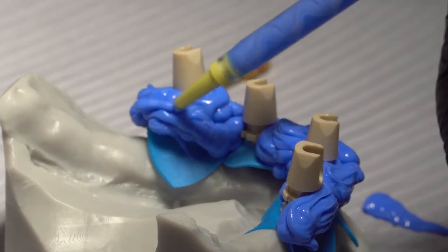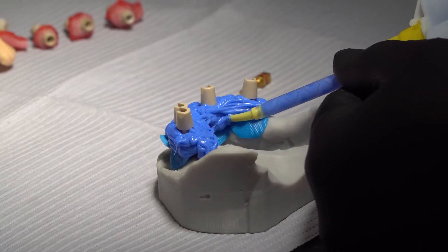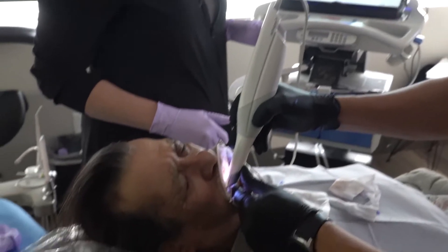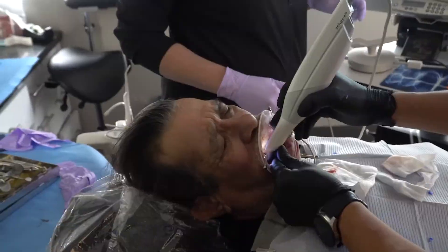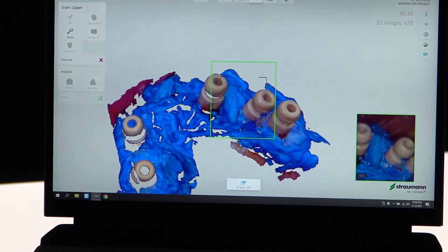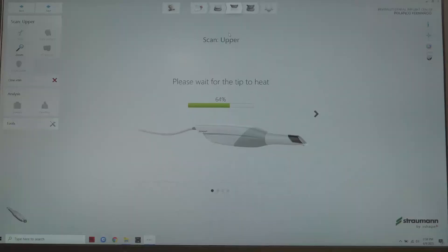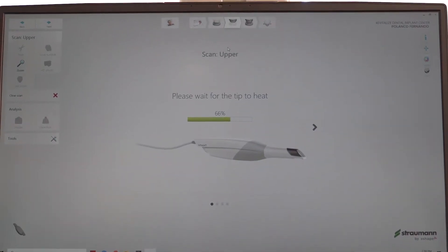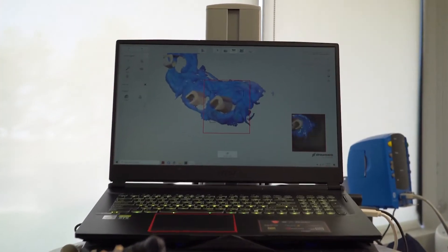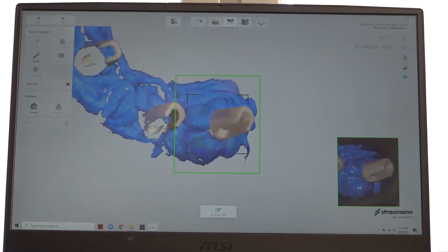I go all around, make sure my scan body is completely sealed, and create a solid base — the same thing as teeth. Now I'm going to use our Trios 3 Basic, which is more than sufficient with 6-micron accuracy to acquire a passive fit restoration. You don't need to invest in a $40,000 or expensive intraoral scanner. Trios is my favorite. Now I'm going to go ahead and start scanning. I usually wait until the tip is warm, same as a facial scanner. When I start scanning I go occlusal all the way — I don't go around like this. I just leave it, put a buccal, leave it there, put a mesial, leave it there, and then go to the other scan body.